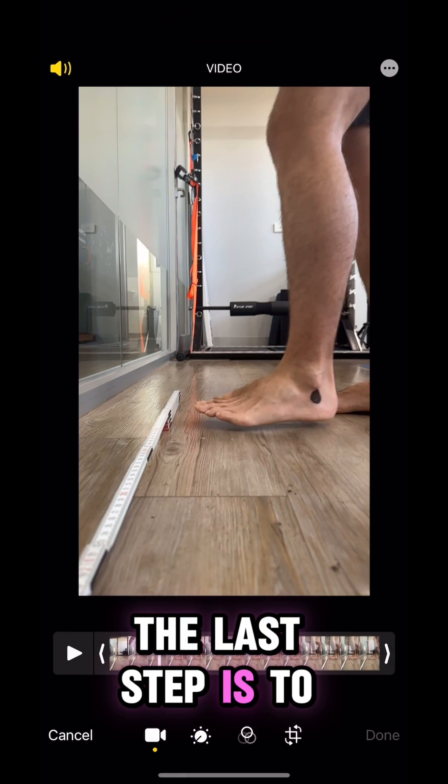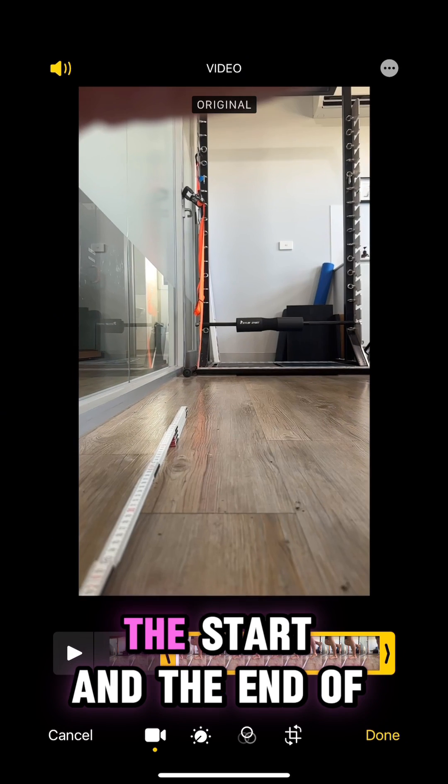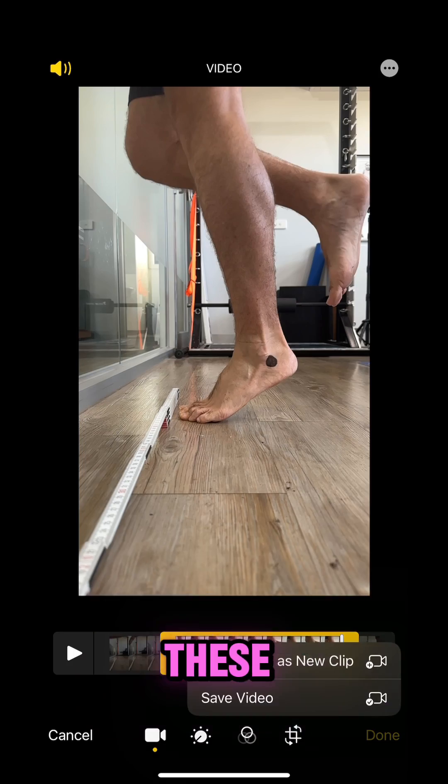The last step is to trim and send the videos. The two videos should be saved in your camera roll. If you can, please trim the start and the end of the video where you are getting into and out of position, then send or attach these videos.